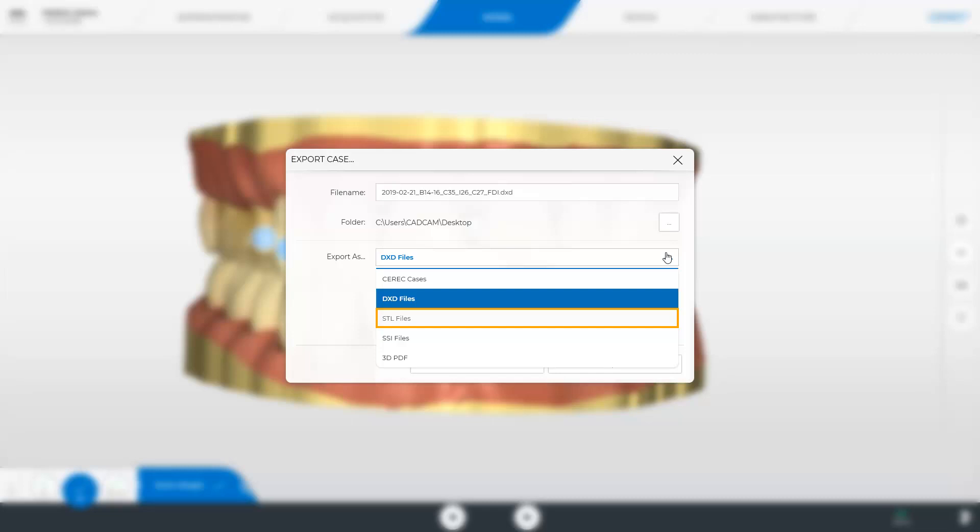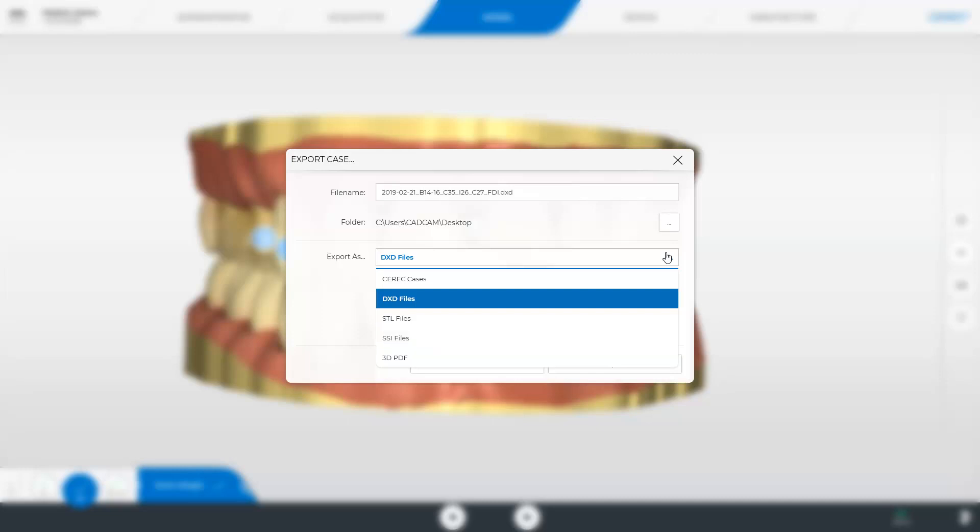Please keep in mind that Dentsply Sirona cannot assume any responsibility for further processing of CEREC STL data using third-party software. The SSI format is available if the CEREC PRO module is unlocked. This file format can be imported for implant planning into the Galileos implant software. A printed copy of the 3D PDF can be handed out to patients or you can email the digital version.